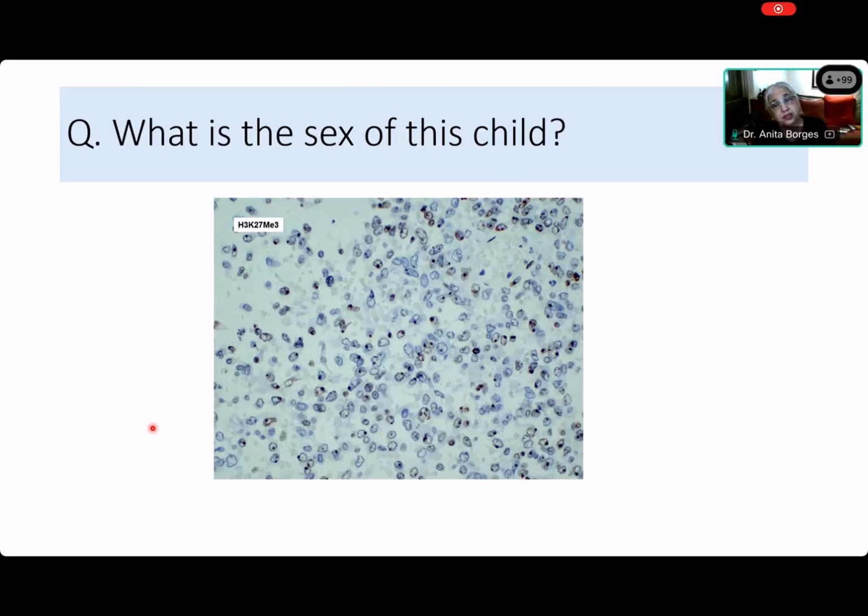But now that you know all this about H3, please tell me what is the sex of this child. Yeah, come on, Priyamada, what is the sex of this child? I told you it was a child. I didn't tell you whether it was a male or a female. So come on. Female. Why is it a female, Priyamada? Because of this H3K27, inactivated X chromosome. Okay, so that inactivated X chromosome is seen as a dot in this nucleus. Very good. It was quite interesting. The answer was a female.